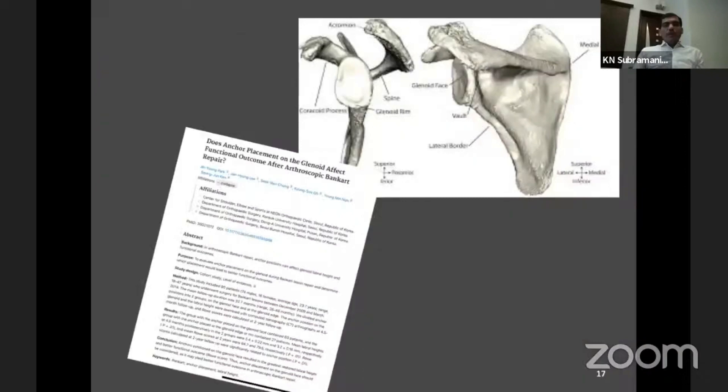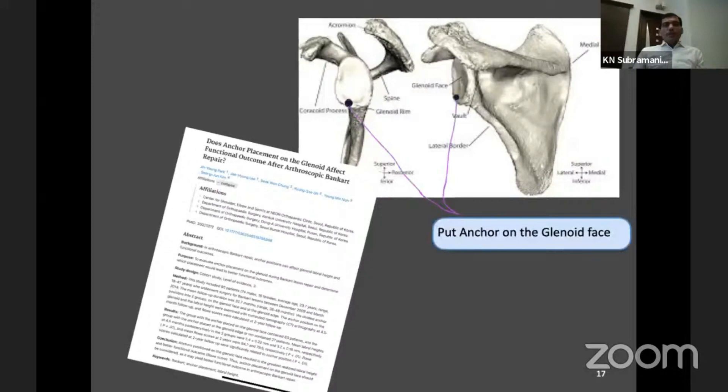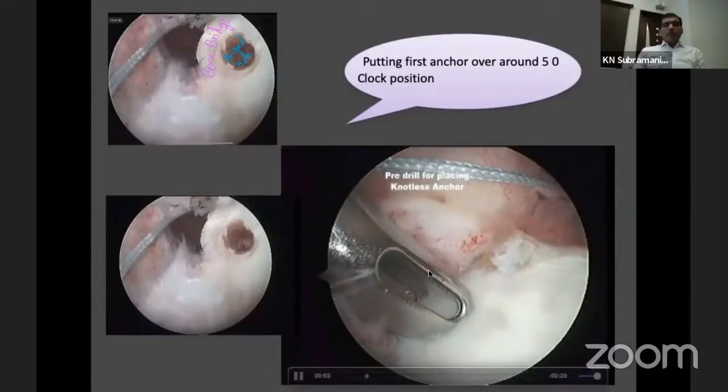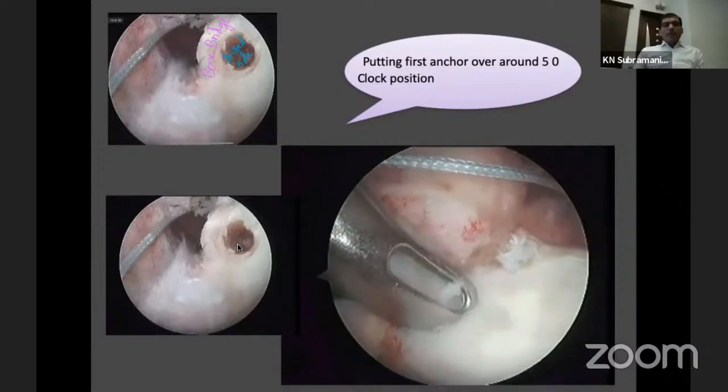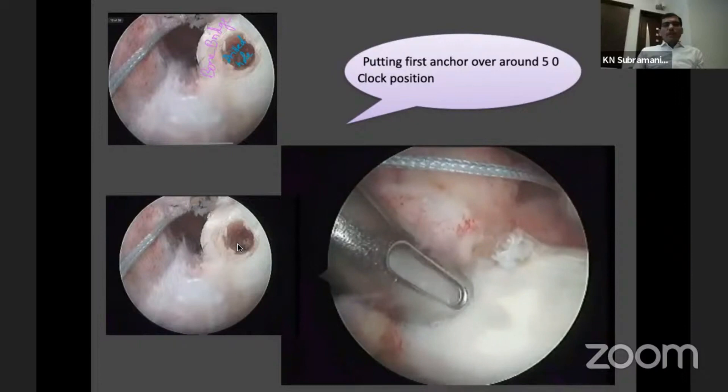Once you have done the tensioning, the next step is to put your anchor. There is debate about whether to place it on the face of the glenoid or on the margin. If you put it on the margin, you are trying to bring the labrum up over the top of the glenoid, which reproduces anatomy better. Place the anchor just over the margin — not below it. At around 5 o'clock position, keep your sleeve there and make a pilot hole leaving a small bony bridge of about 2 mm; otherwise the anchor can slip. Once the pilot hole is done, load the anchor.